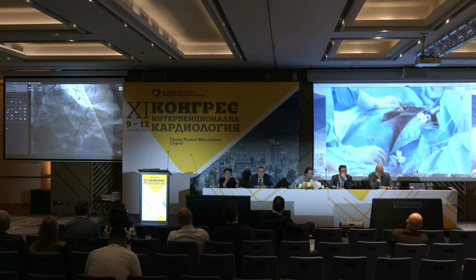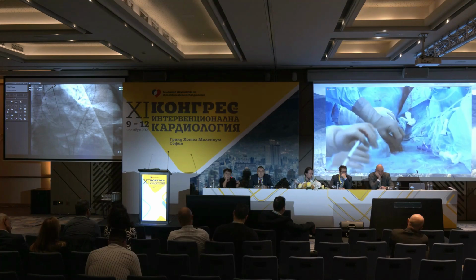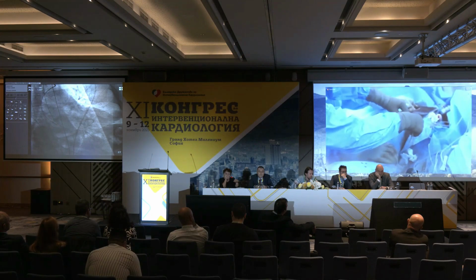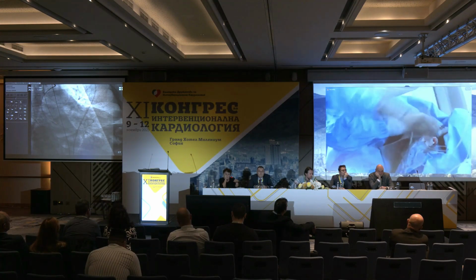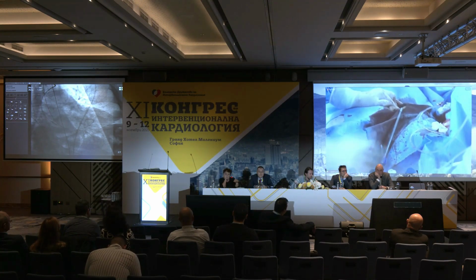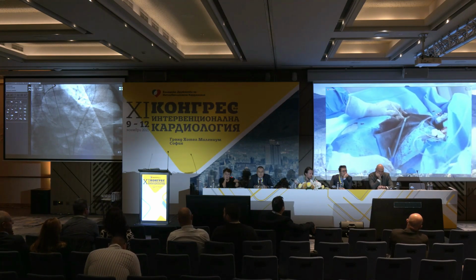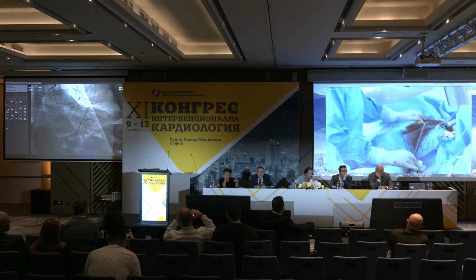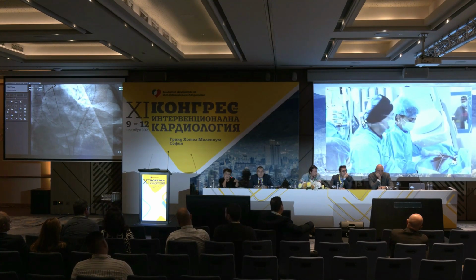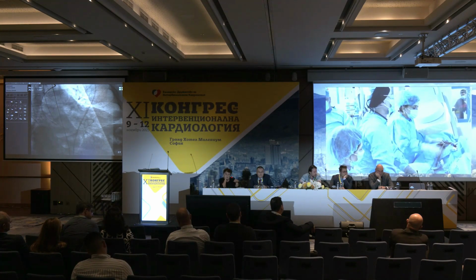Can you explain to the audience here why you chose the Evolut valve? We chose the valve because the size of the annulus complex is quite big. The second one is we have a patient with bicuspid pathology, and we need to use a system with a strong radial force to get good hemodynamics.